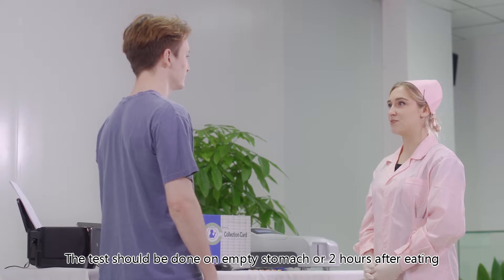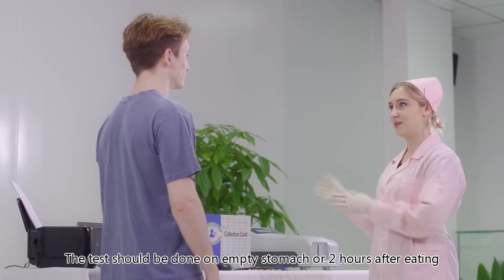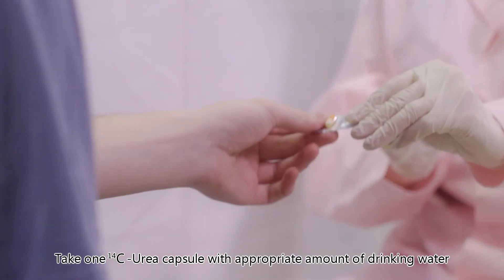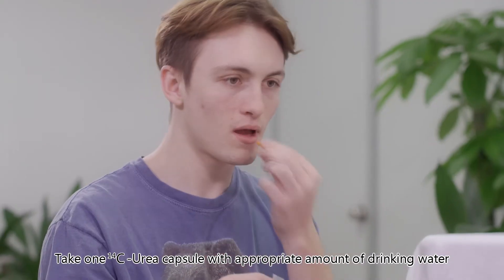Sample collection: The test should be done on an empty stomach or two hours after eating. Take one Carbon-14 urea capsule with an appropriate amount of drinking water.